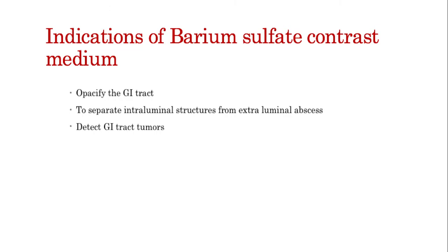Now, I talked before about density and subject contrast within the abdomen. Assuming there's an abscess in the abdomen and we take an x-ray, we cannot see it because the abscess will have the same density as the tissue inside the abdomen. So this is quite a disadvantage.